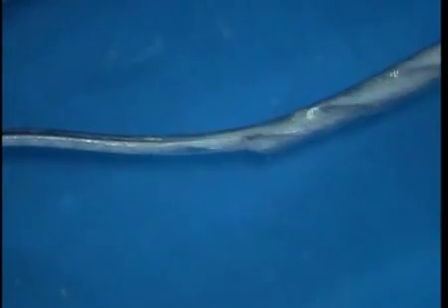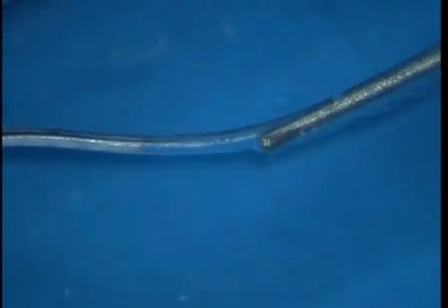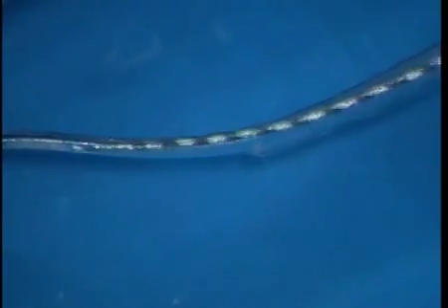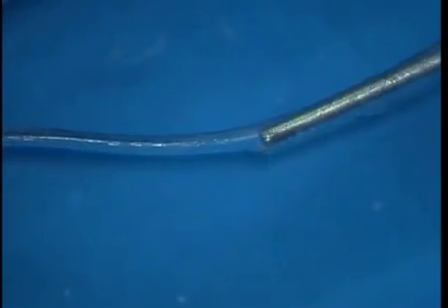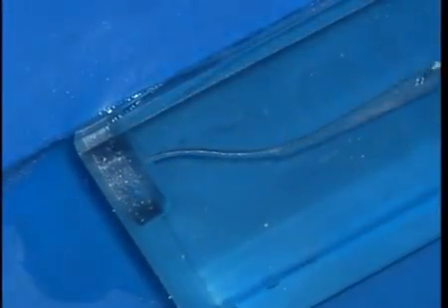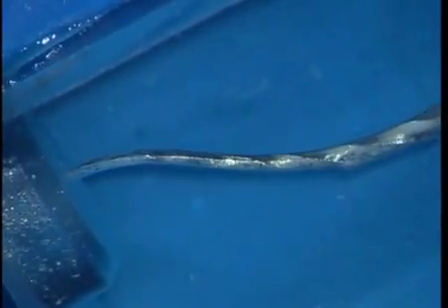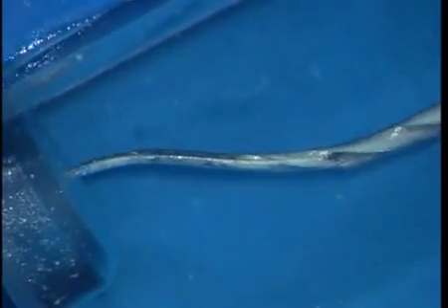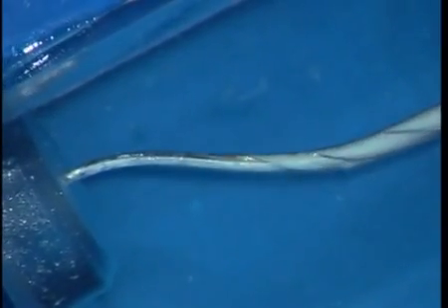Because this instrument has greater tapers as compared to an ISO 02 tapered file, a little bit of rotation on the handle draws the instrument in and begins to buff out the ledge on the outer wall. Irrigate, recapitulate, and re-irrigate to move debris into solution. To progressively manage the ledge, we use a ProTaper Shaping file 2. Again, the pre-curved instrument bypasses the ledge. Its greater diameter cutting blades refine and smooth and plane the walls and begin to reduce the ledge even further.